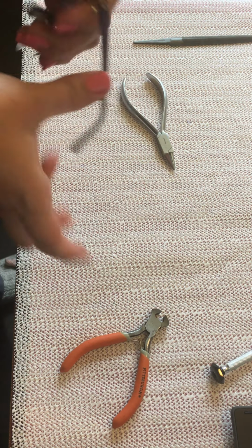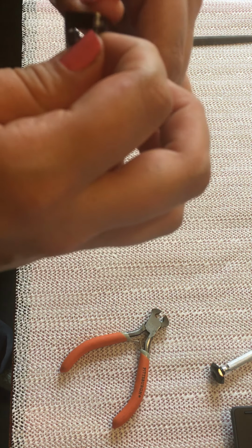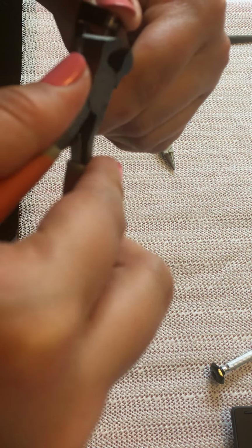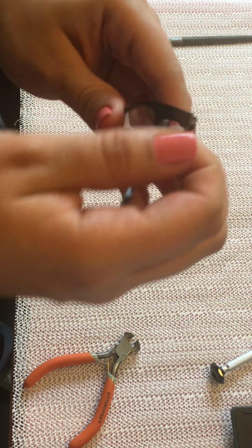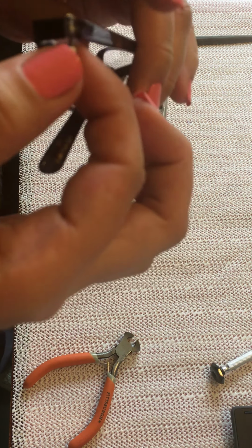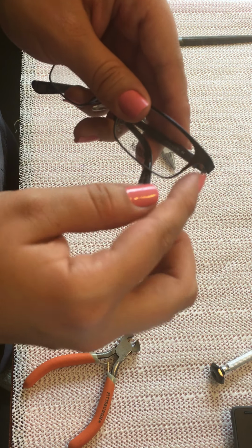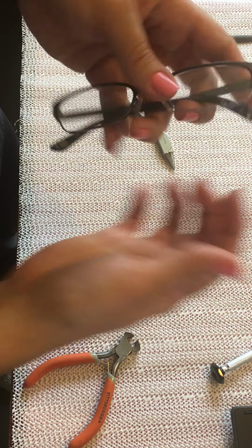Okay, now on this side, we still have the little problem here. I'm gonna try to move it with the clipper. But the only thing that I see, it might be that I can't do this one. I think it got stuck. I think this one got stuck right here. I think it got stuck because I'm trying to move it, but it does not seem to go up.